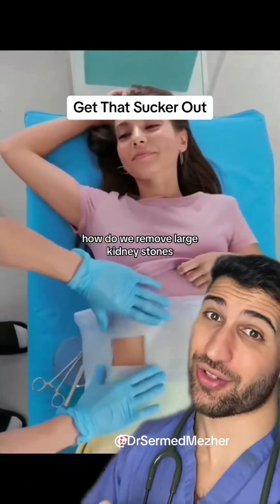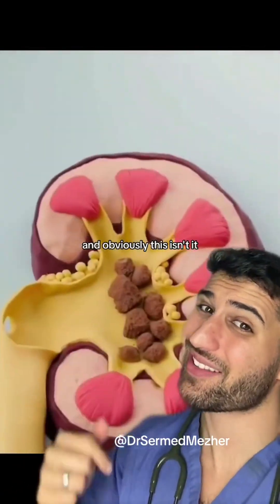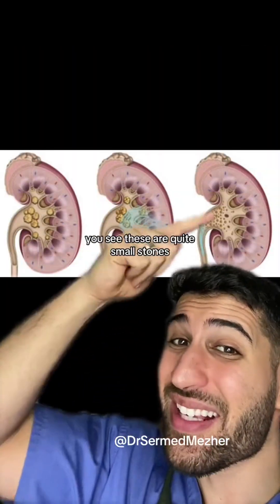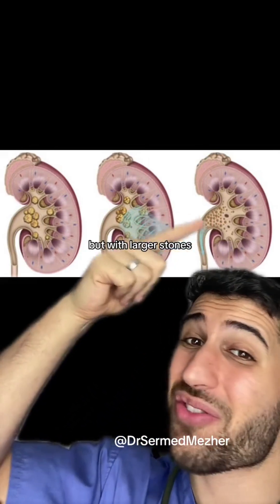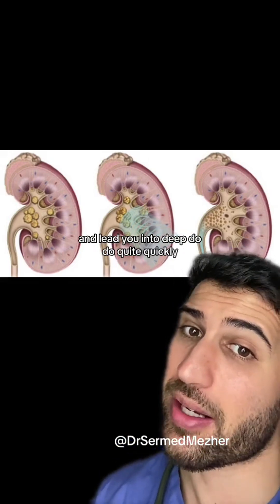How do we remove large kidney stones? Usually we want to use the least invasive route, and that's actually shockwave therapy. These are quite small stones, so when they break up the fragments are quite small and they just pass. But with larger stones, these fragments could cause an obstruction and lead you into trouble quite quickly.